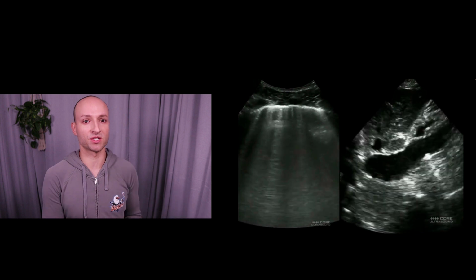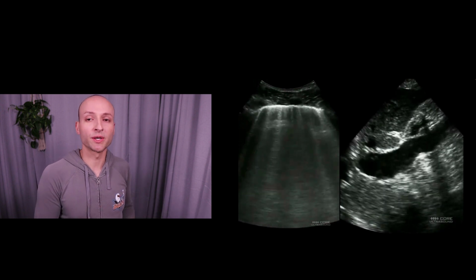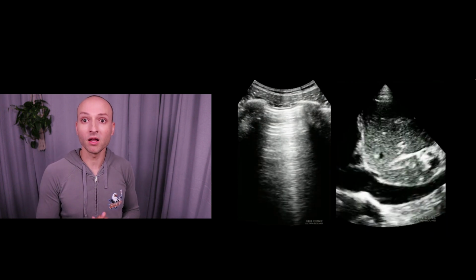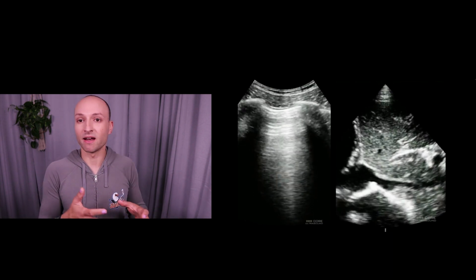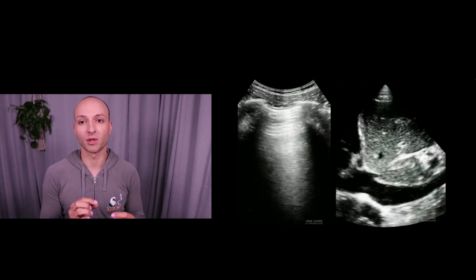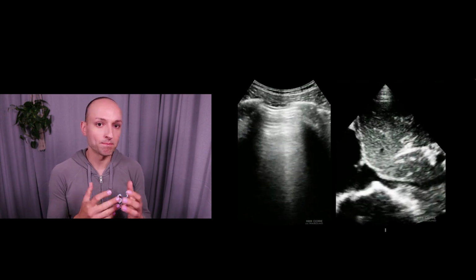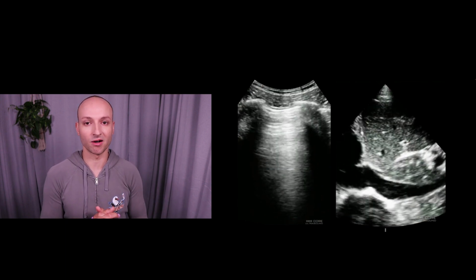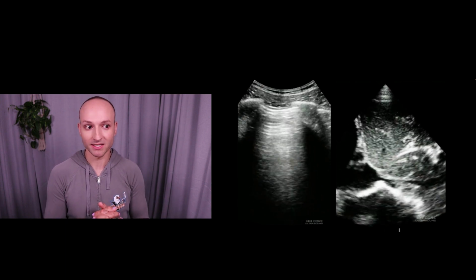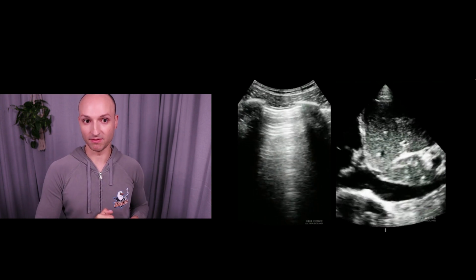If I see this on a patient that's hypotensive, I'm unlikely to give a large amount of fluids because there's a chance the patient won't tolerate those fluids very well. Whereas if I see a bunch of A lines on the left and a very flat IVC on the right, I'm much more likely to give that patient fluids, assuming the fluids are not going to harm them. Both volume responsiveness and volume tolerance are important and should be discussed. But the point of this was definitely volume responsiveness.